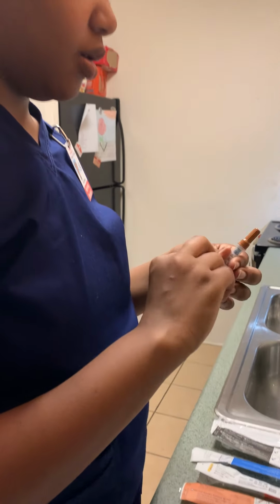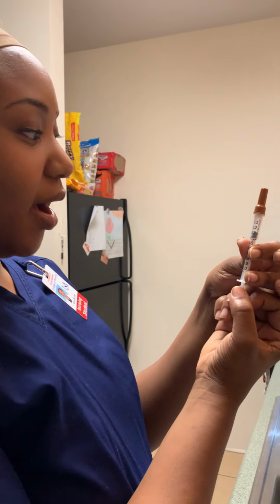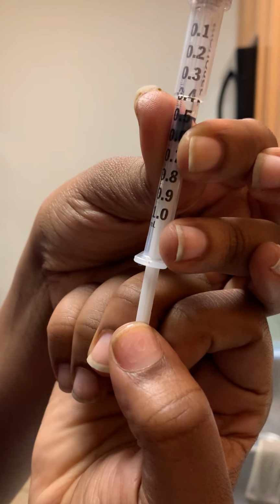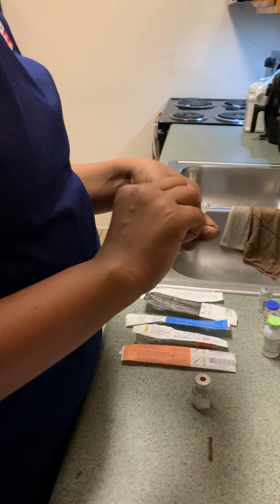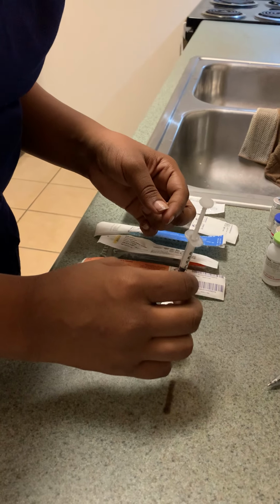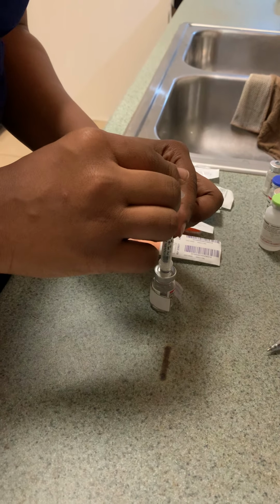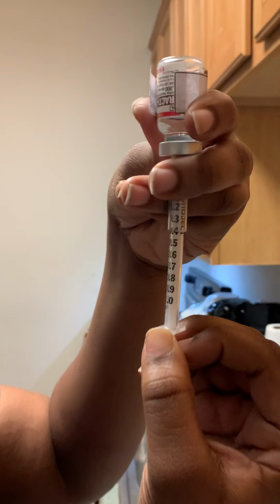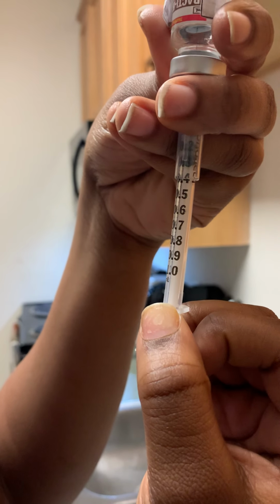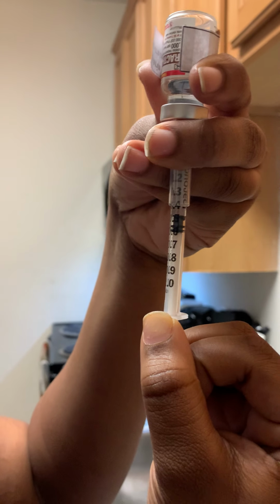Now I will retrieve 0.5 milliliters of air before I begin. I'll remove the cap and place it on the countertop. I will insert the air into my vial. Now I will retrieve 0.5 milliliters of the medication.